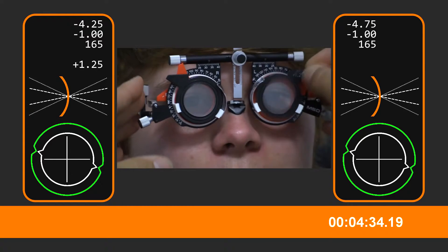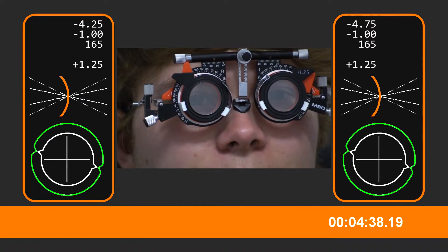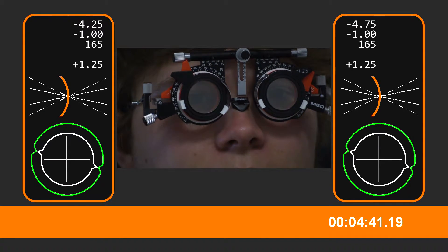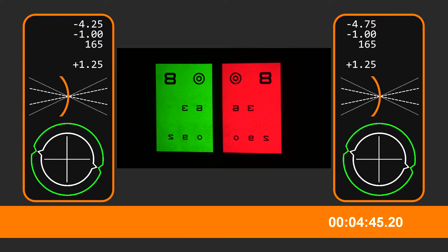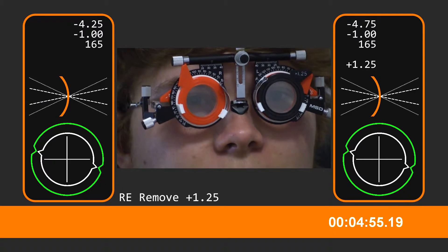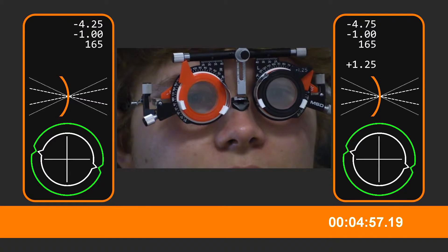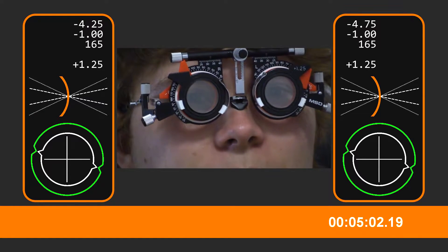Let's come back to the right eye now. Red and green — which is sharpest and clearest? I can't see the red at all. It's not bright. Can you see which is clearer? The green. And what about now? About the same.